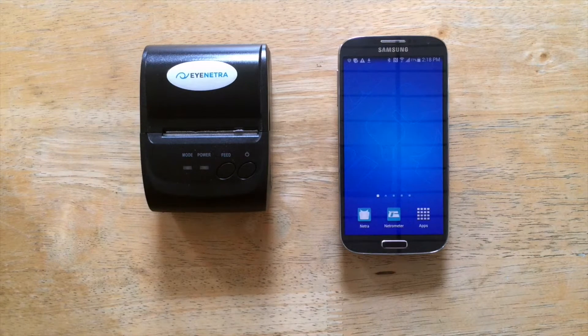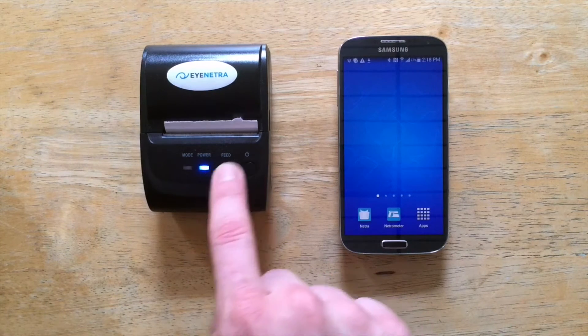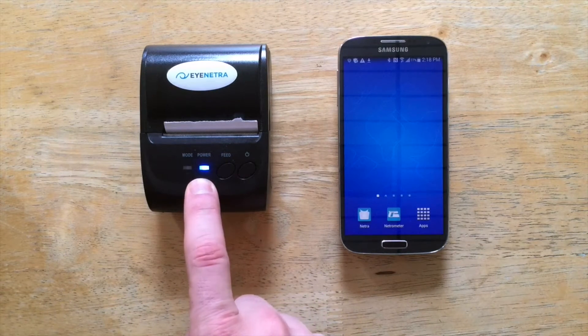To do this, we'll start by powering on the printer by pressing and holding the power button. The blue light will illuminate as soon as it is powered on.